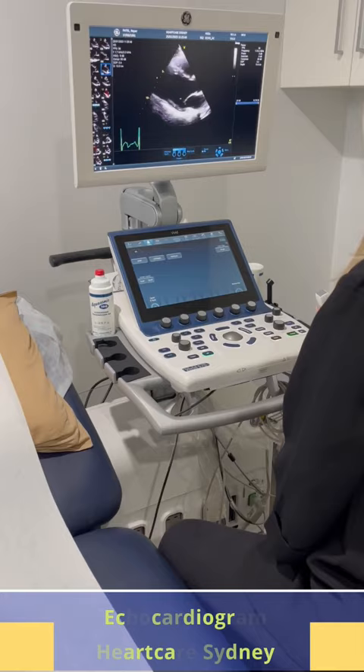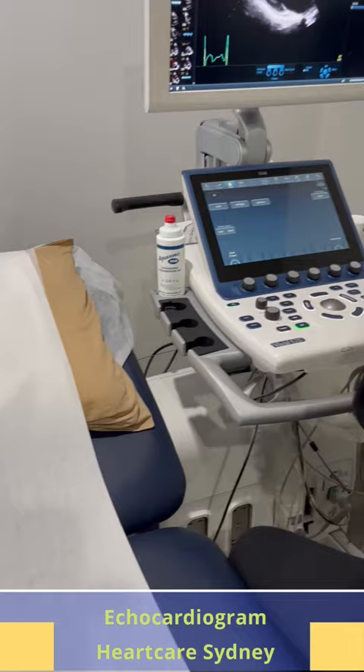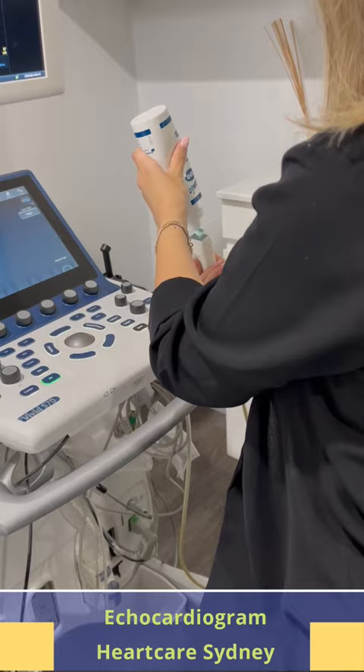The sonographer uses a transducer, a handheld device, to send and receive ultrasound waves. A clear gel is applied to the chest to enhance the ultrasound waves transmission.